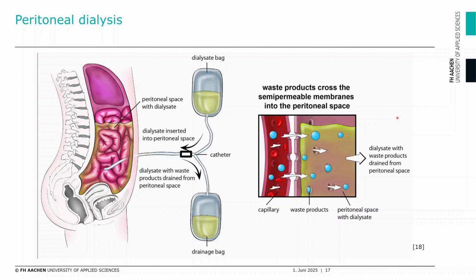As the effectiveness of peritoneal dialysis depends on the morphology and changes in the peritoneum, the patient must always perform a PET test, the peritoneal equilibrium test, before each treatment to determine the permeability of the peritoneum and thus the effectiveness of the treatment. So the PET serves to assess the peritoneal transport situation, evaluates whether PD is possible, shows how good the permeability of the peritoneum still is, and determines the choice of filling volume from 0.5 liter to 2.5 liter.